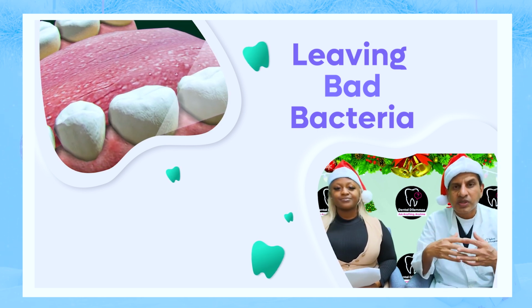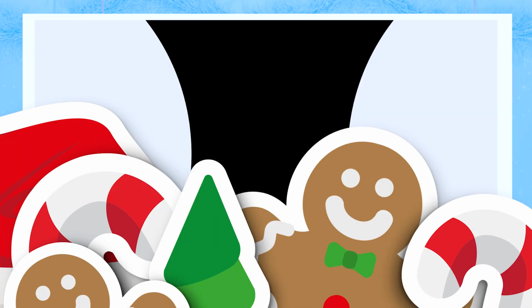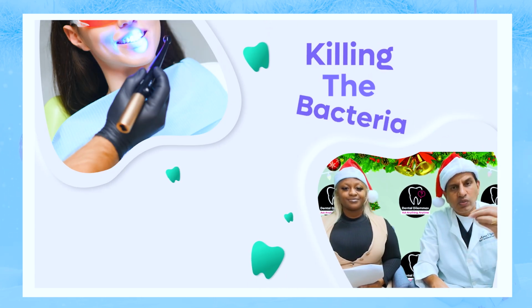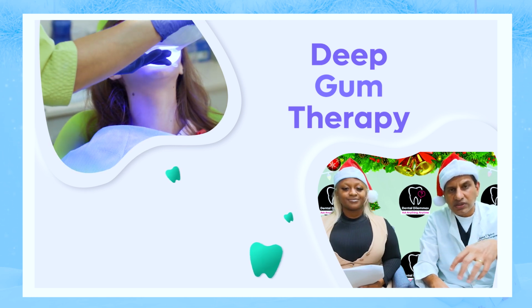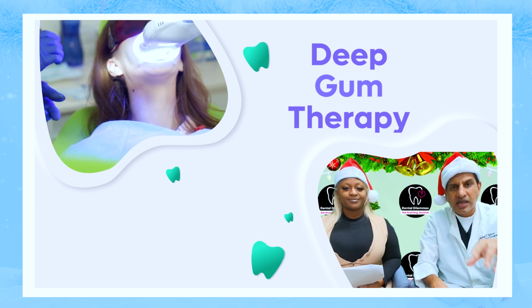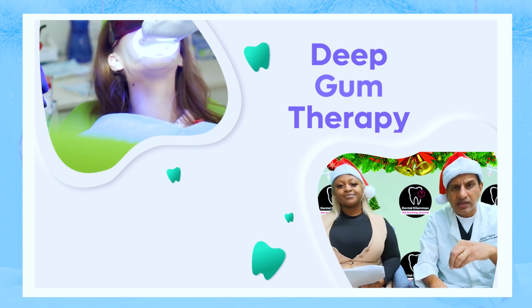What we do in our office is we offer the regular cleaning along with the laser, and we offer the deep cleaning. Whenever we offer the deep cleaning, or the deep gum therapy as we call it, we use the laser after we finish to decontaminate the gum and do what we call a laser bacterial reduction also.